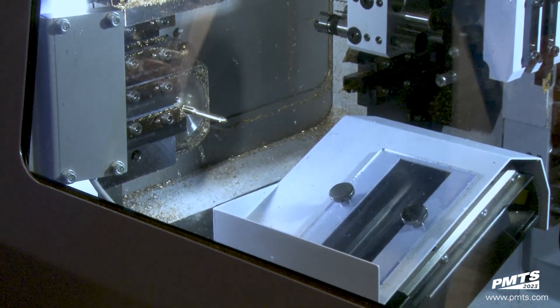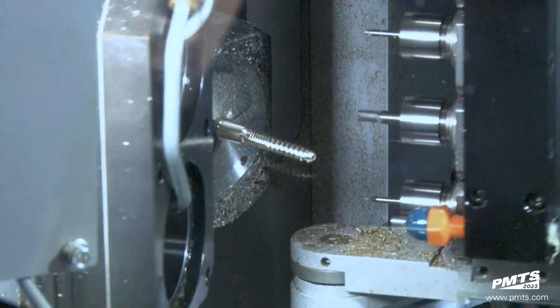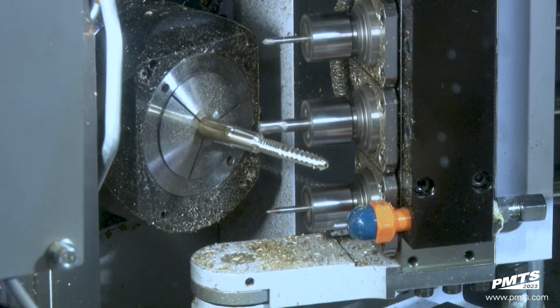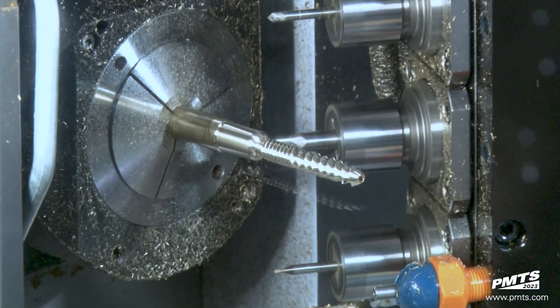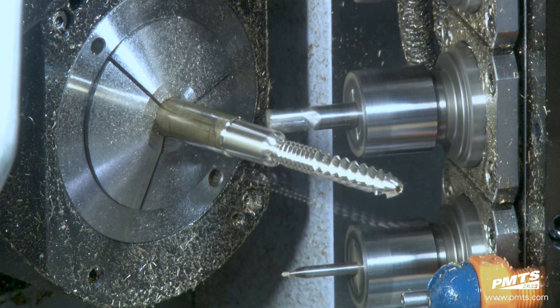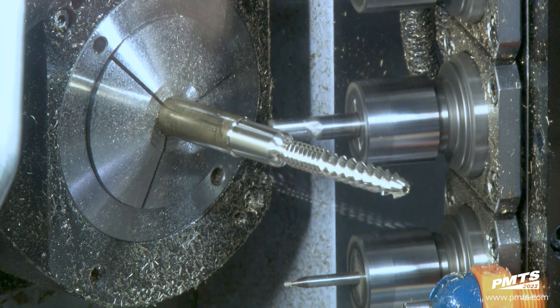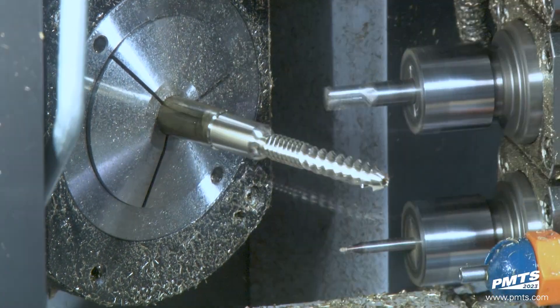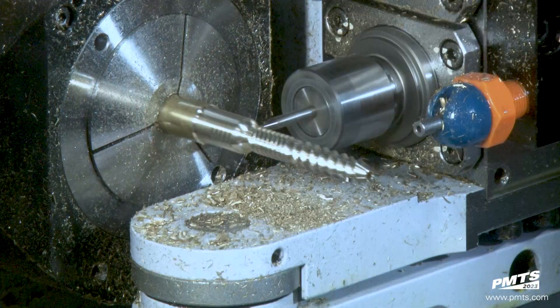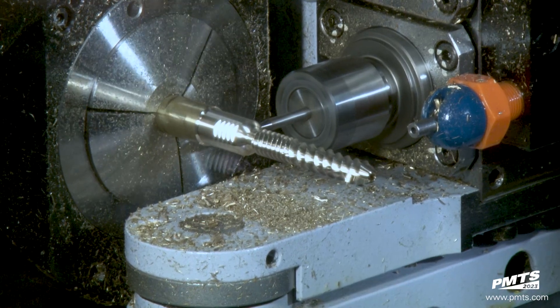We have our parts ejector that just advanced, bringing out the old part and preparing itself for the cutoff. Right now the B1 axis is working one of the spindles. A lot of these spinal screws have a lot of detail on the heads — every OEM has different designs for the heads. To have one machine able to articulate and move in every single axis and surface is going to accommodate any kind of screw that new designers come out with.